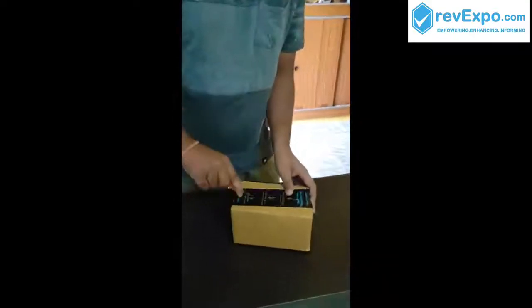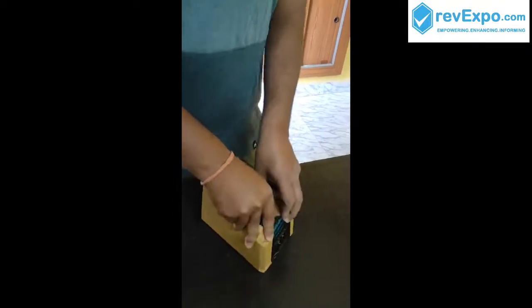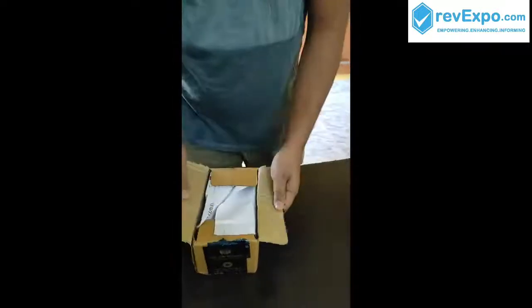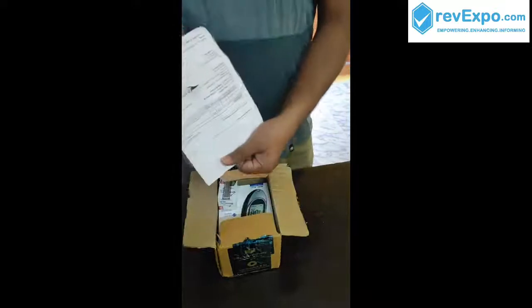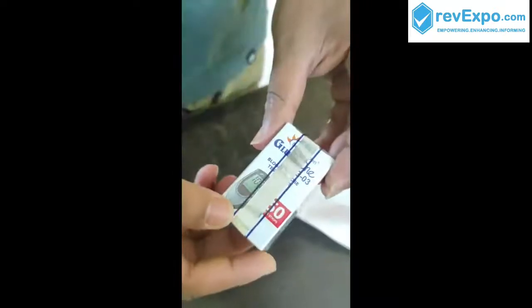I am opening this box. I have paid 807 rupees for this. This is the company Dr. Morphen BG03 Gluco 1 Glucometer Combo 50 strips, multi color. Here is the 50 strips box. And here is the manufactured date and the price. Completely sealed with hologram, and this is the seal.